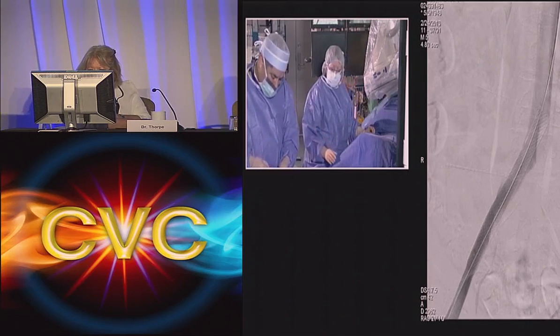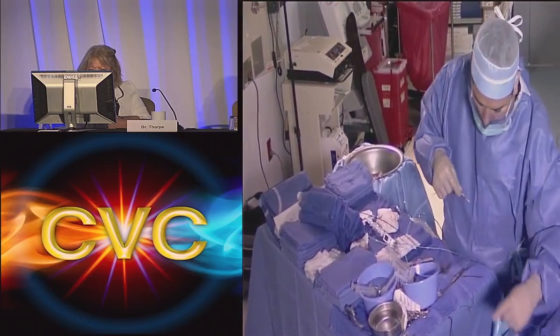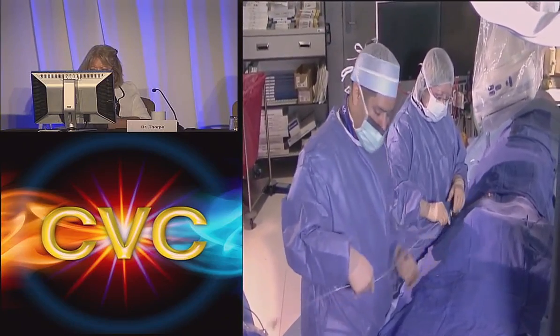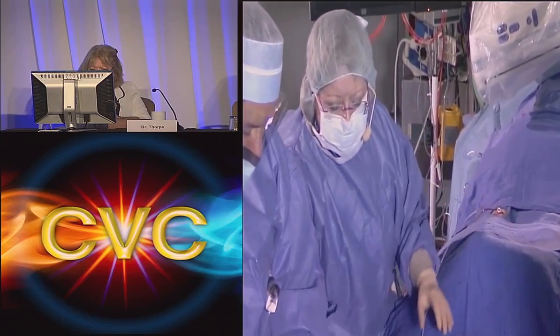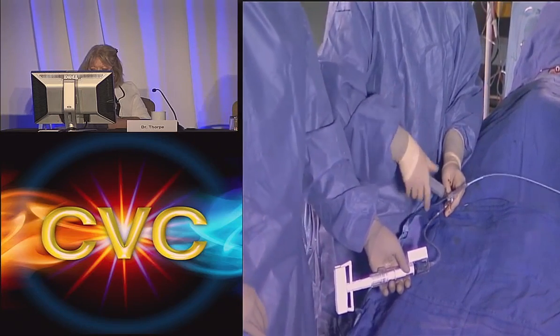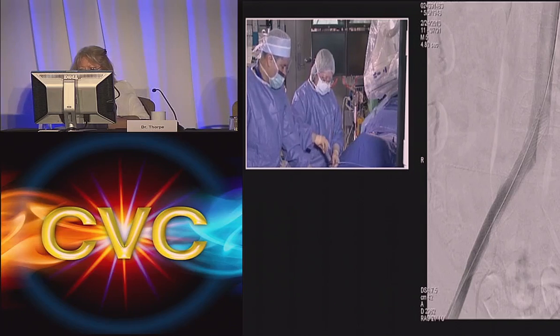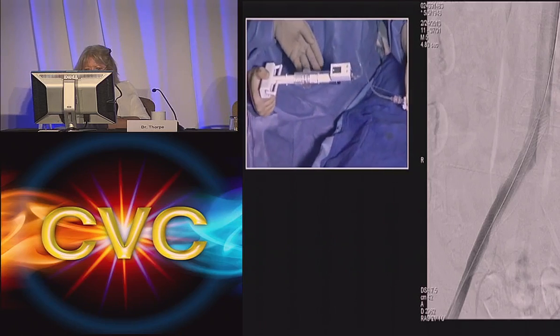Let's go up with the 16 balloon. We'll dilate our stent just to make sure it's completely opened against the wall. Can you give me an empty syringe, please? Need those balloon wings really far down so you go up into the stent with it open. It's nice to use a new balloon when you're dilating a stent. Okay, get the air out. Okay, there you go. Cool.